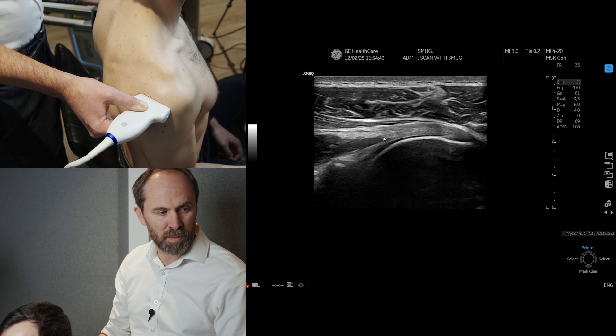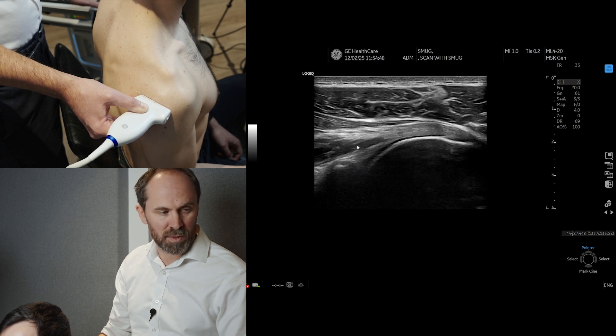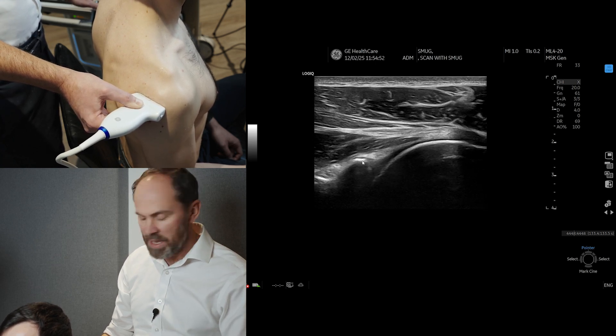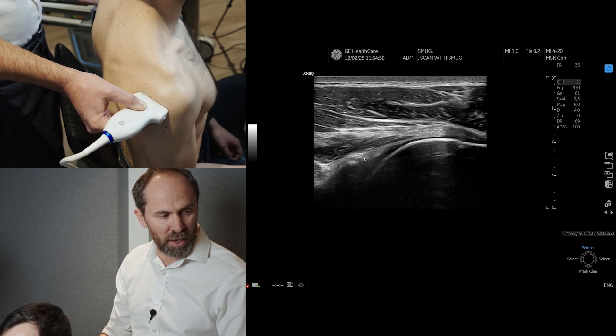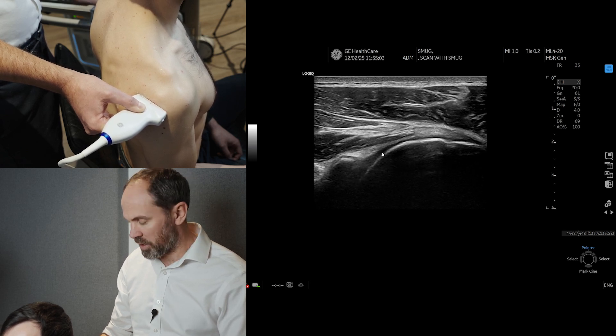This is the muscle belly of infraspinatus here, and underneath that you can see the muscle belly as well. This is the intramuscular tendon. If we come more medially, we can see the spinal glenoid notch here. We've got the glenoid, and then we've got the labrum here, and then you can see the capsule coming over the top with articular cartilage.